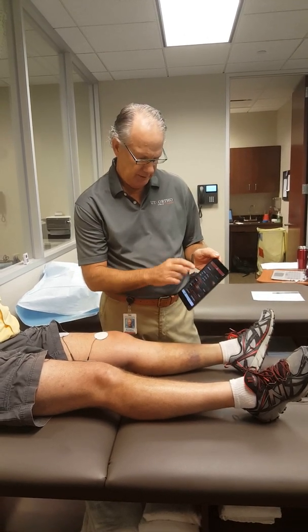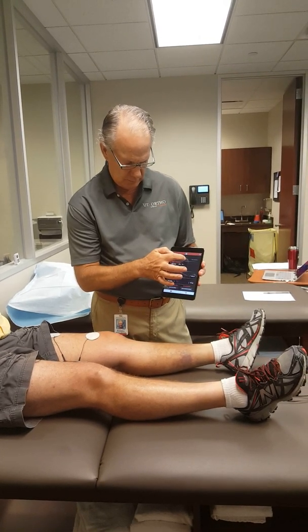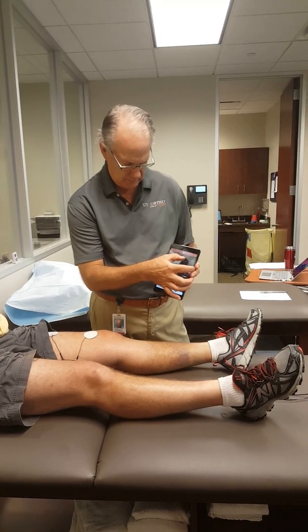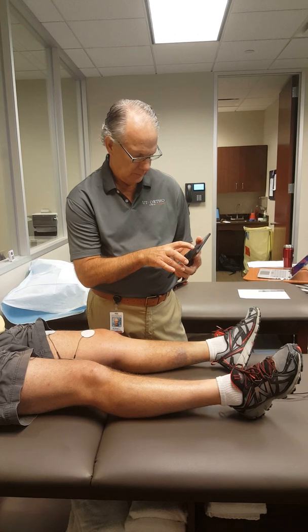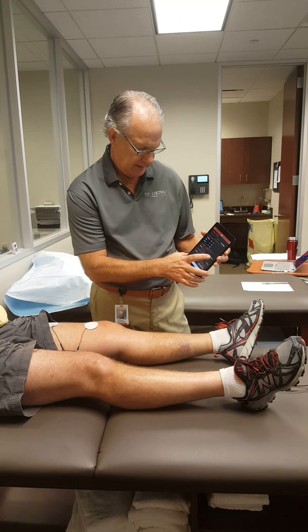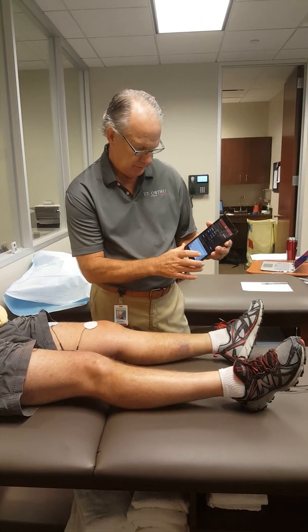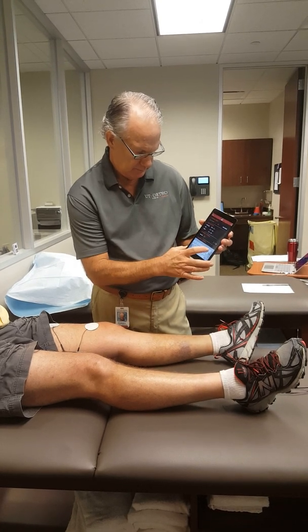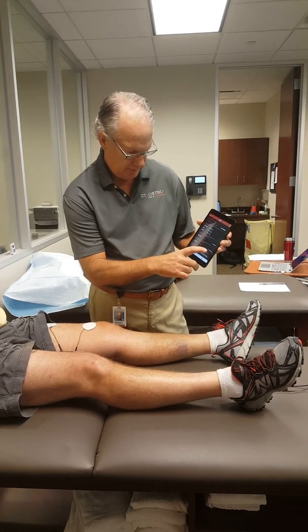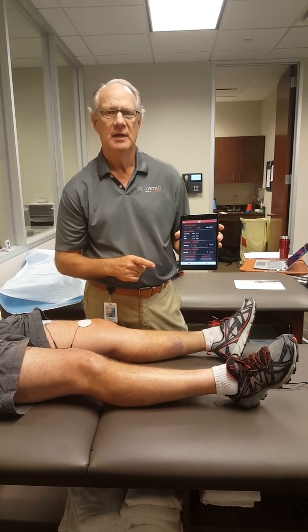Go to settings and you need to switch it from single to dual channel. Then we'll go to the channel settings and try to get that even. We're going to put this one at 1000, and the other one is set at 1000 — you want channel 1 and channel 2 to be at the same settings.